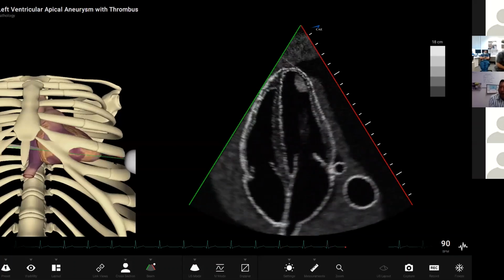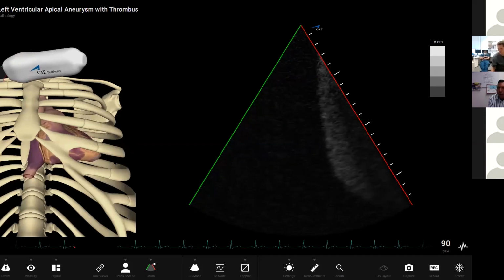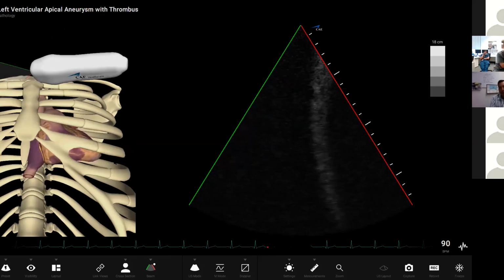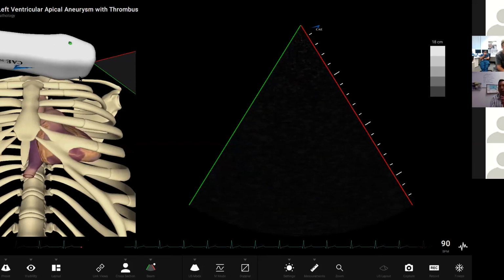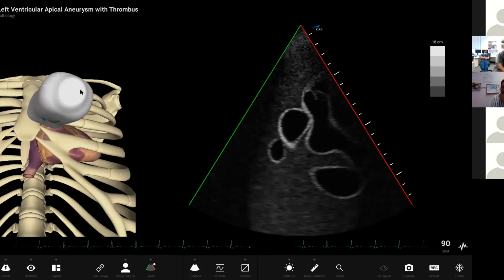Sam? Yeah. So with the different probes, when you decide to switch between different probes, because some of the machines we do have sector probes, I forgot, it's S5 and S8, something like that. If you're with a department that's got money to buy lots of different probes, you sometimes have pediatric probes and adult probes. I always think for echo you need the phased array probe. But even with those phased array probes, there are 2 different probes. Yeah, pediatric probes.